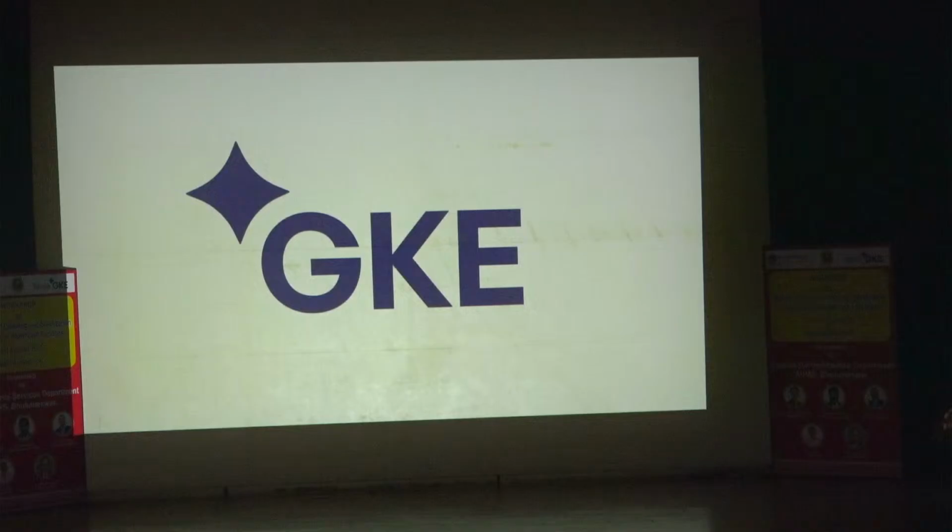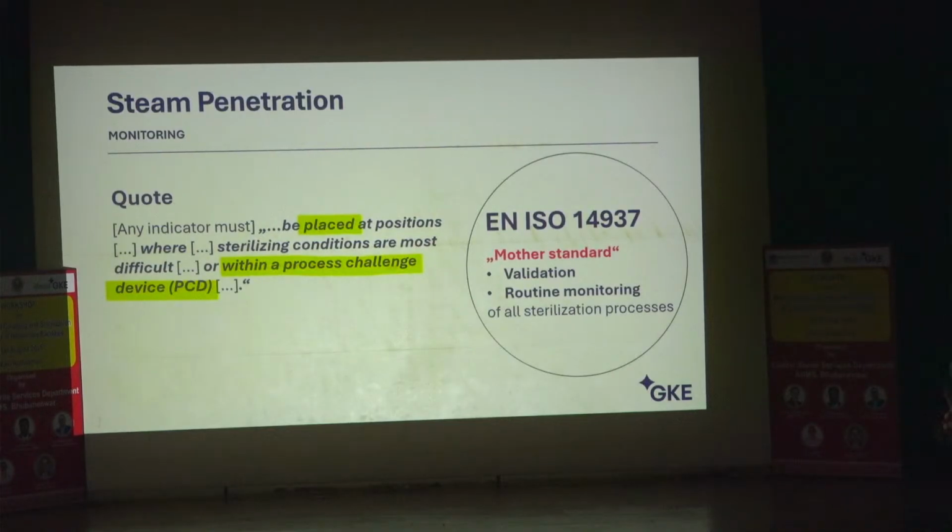So, here we go. Last two slides. Let's read together these two quotes from the standard 14937, which is the general, the mother standard of validation. There you see what it's all about. Any indicator, no matter if it's a biological or chemical one, is to be placed at positions where sterilizing conditions are most difficult, or in a PCD.